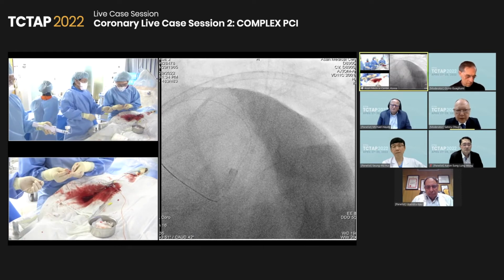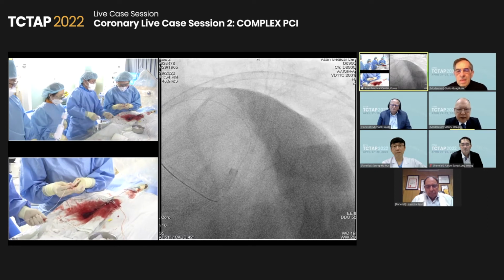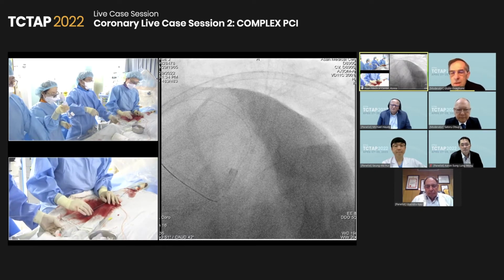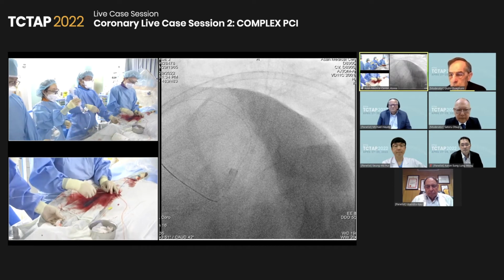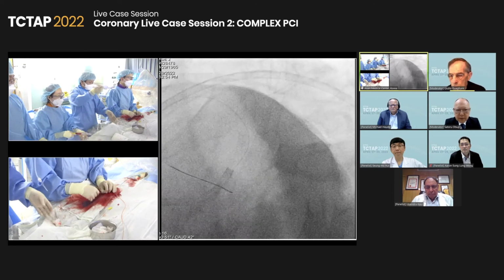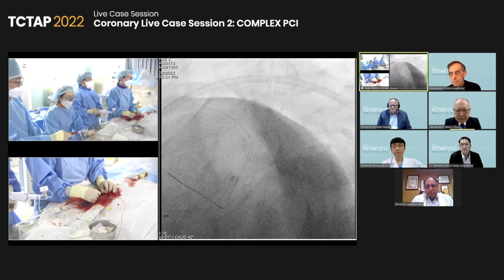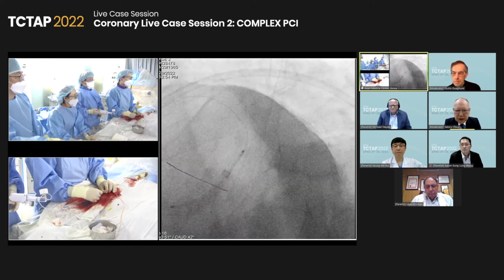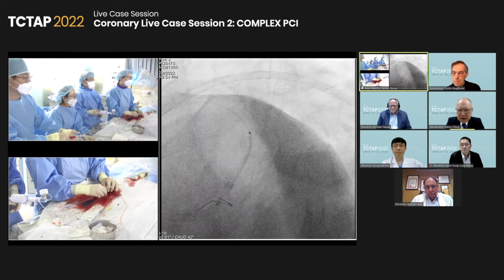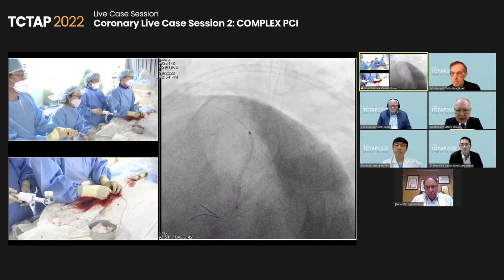Julio, how about the rotablator before ballooning in this case for the LAD? That would be another good idea. The point is that the lumen was quite big, so in this case you need a very big burr to be effective. But we cannot use a big burr in this nodular calcified region, because the wire bias is not toward the nodule, but the healthy side.